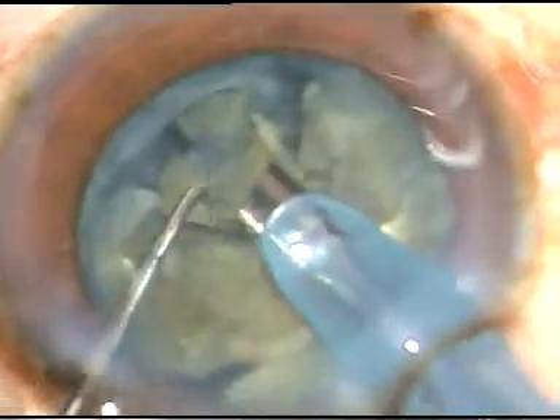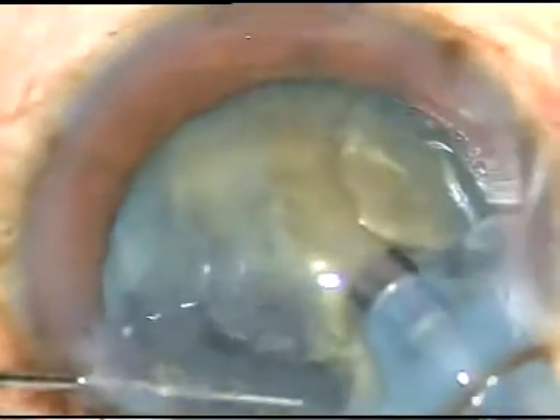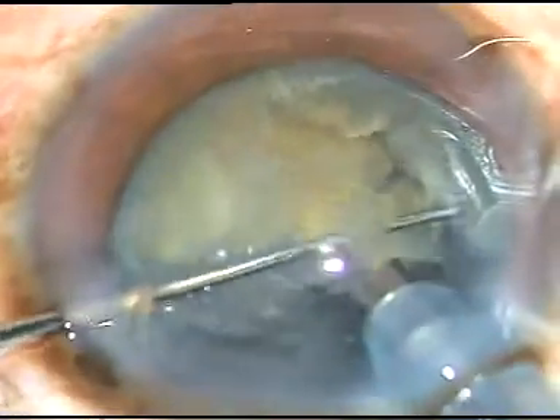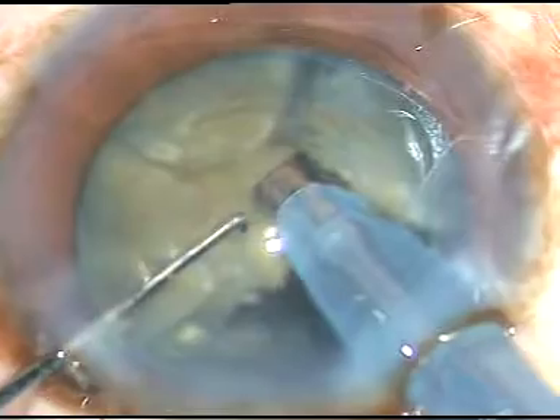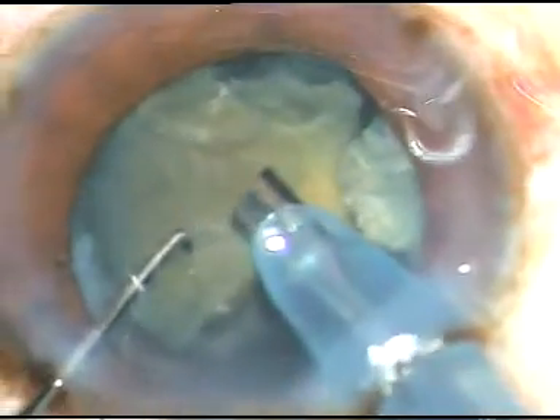At this time, the phaco power in this case is 65%, flow rate is 45 ml per minute, and vacuum is 450 mmHg. Almost half of the nucleus has been removed. Now this portion — this other half — I divide these parts again, and emulsify and take them out.